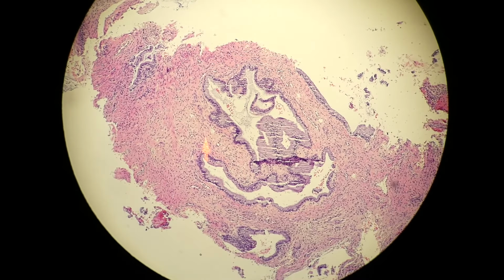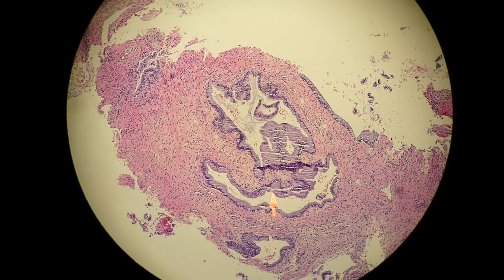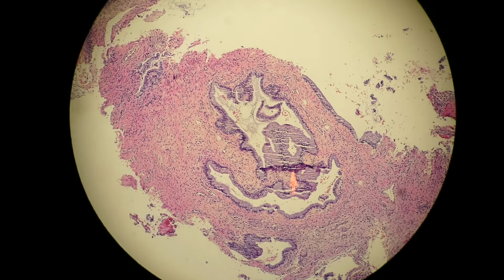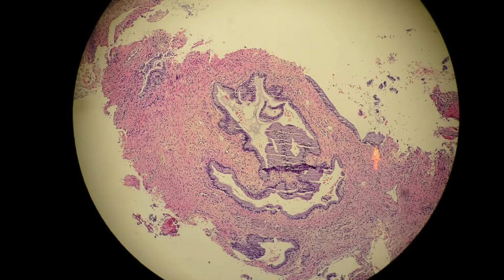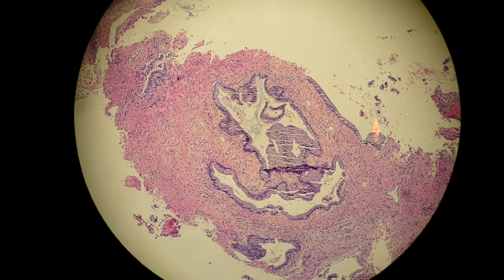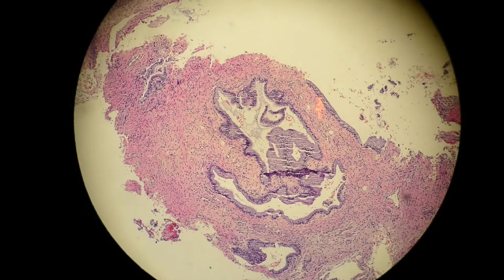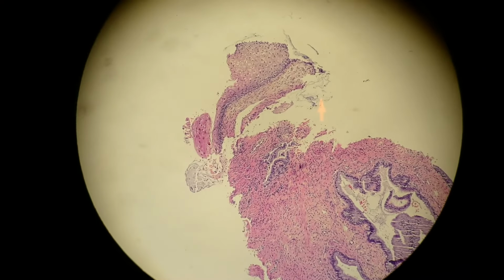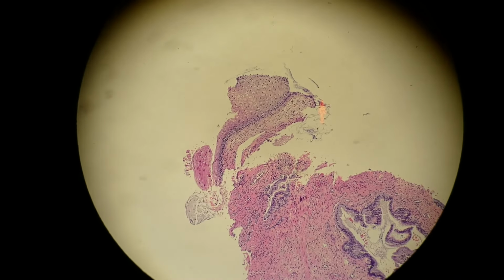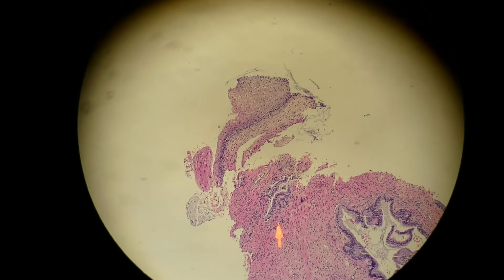So here you can see a cross section, and these are glandular cells or endocervical cells. They're columnar shaped and they secrete mucus. Here likewise is another area of endocervical cells. And then out here in this outer layer are the squamous cells.